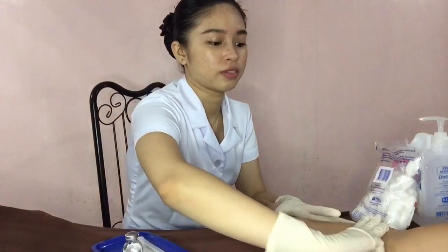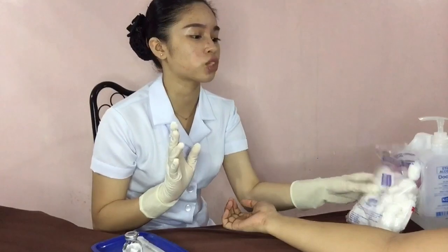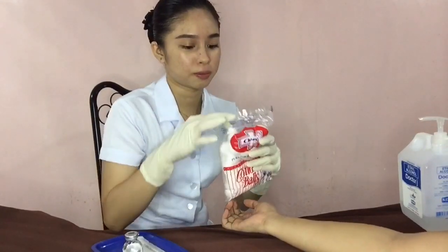Now choose an injection site that is free from lesions and discolorations, below the antecubital space and one hand above the wrist. Position the patient's arm so that the elbow and forearm are supported on a flat surface. Apply clean gloves. Then use an antiseptic swab to clean the site, beginning at the center and moving in a circular motion outward, about 2 inches or 5 centimeters.